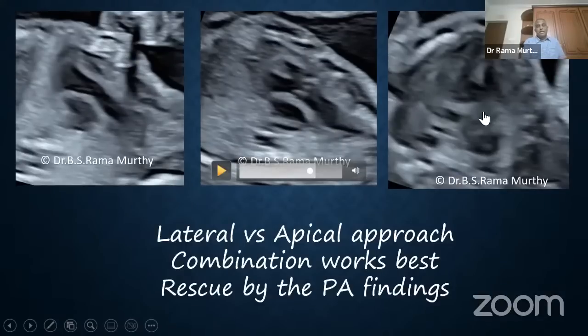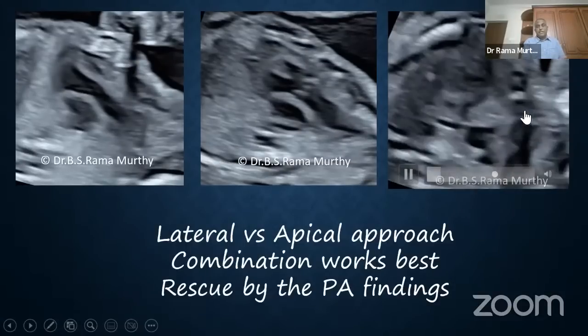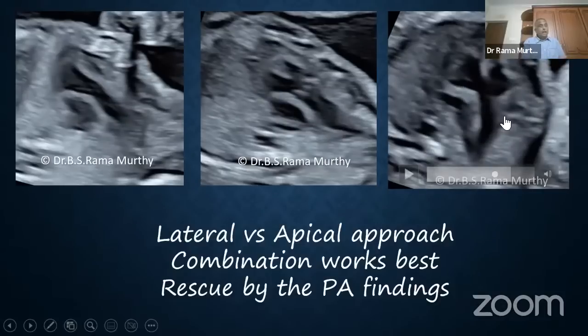Now let this stay here, and I'll go here. And this is another case. This is another picture done from another angle, apical angle. You find that this is the aorta, this is the VSD, and clearly collinearity here. Both the ventricles have access into the overriding artery, malalignment. So you have normal aortoseptal continuity. Here you have a membranous VSD because of this gap, but no malalignment, and here you have malalignment.